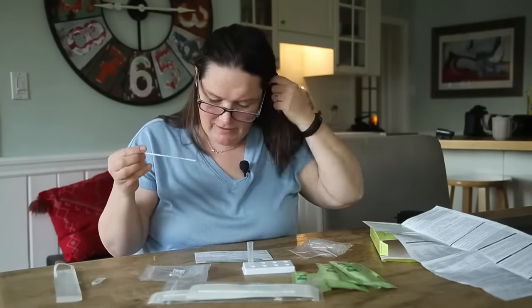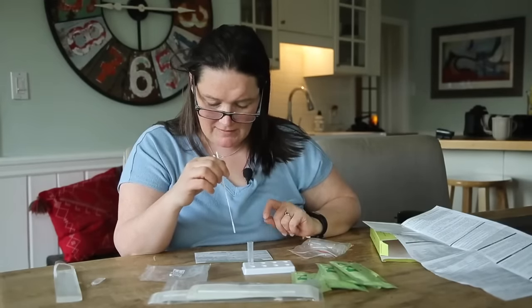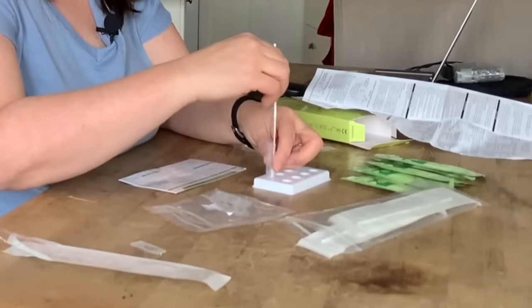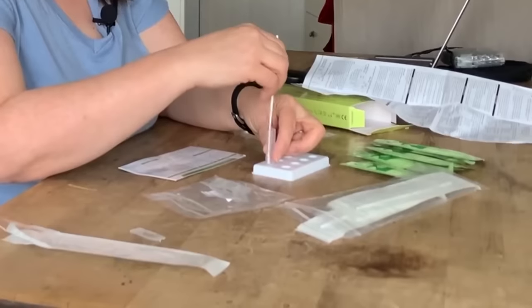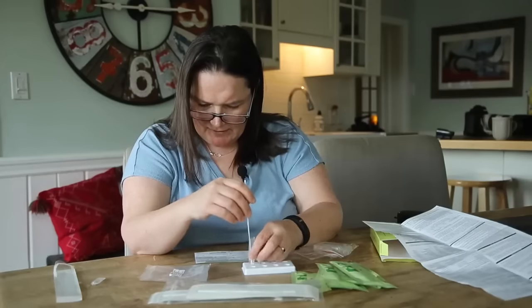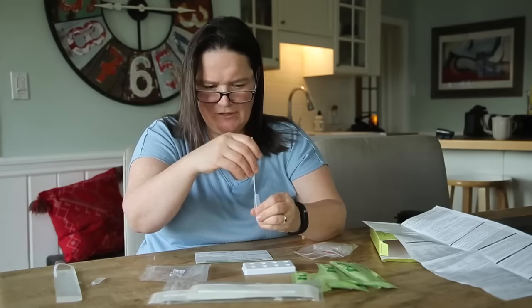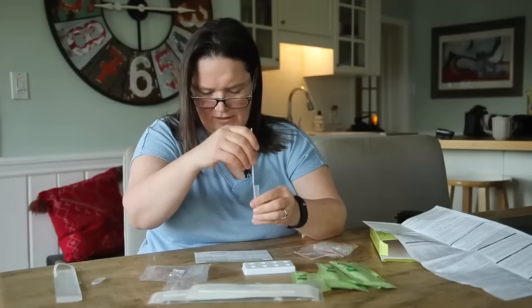Step three: insert the swab with the collected specimen into the extraction tube. Swirl the swab, mixing well. Squeeze the swab 10 to 15 times by compressing the walls of the tube. So we'll swirl it — we're swirling, mixing well. It's a proper little science experiment here. Squeeze: one, two, three, four, five, six, seven. You want to get as much of the stuff from your nose into this liquid as possible.